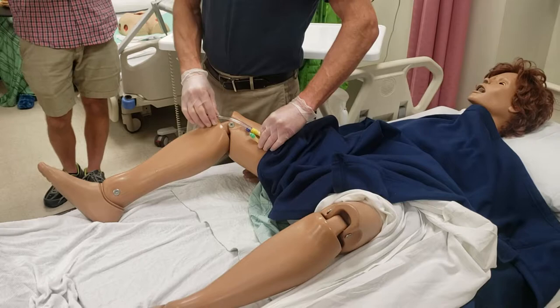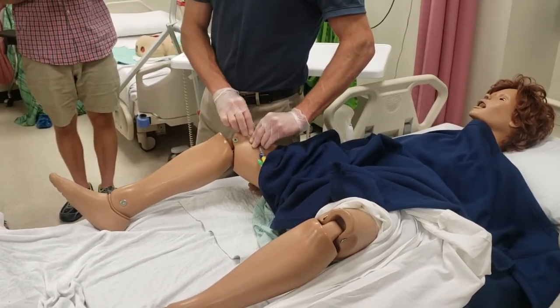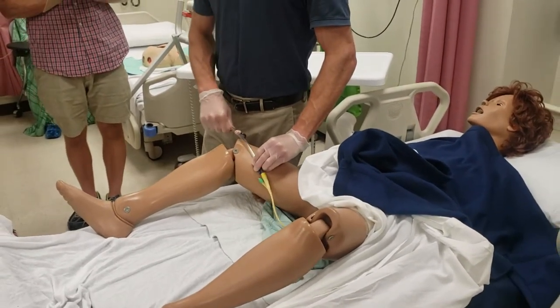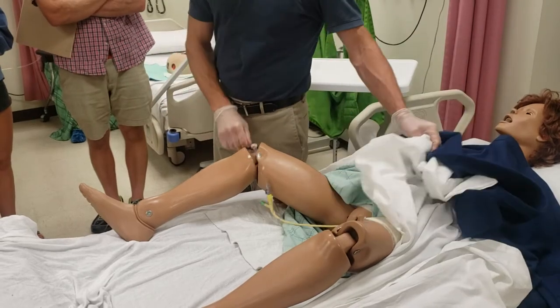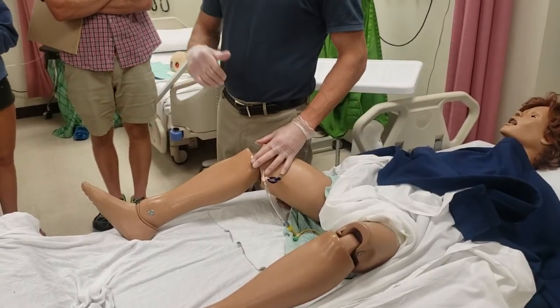The whole point of securement is that when tension pulls on the catheter, it's pulling on the tape — not on the urethra. If I need a sample, I can get it right now from the bag upon initial insertion — that's the only time you can get it from the bag. Next week I'll show you how to get a sample out of the aspiration port.